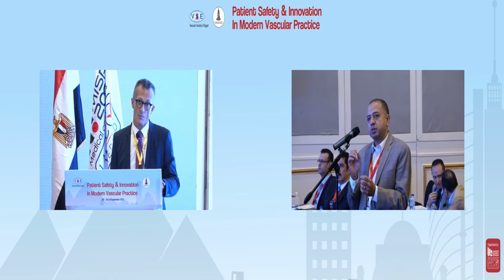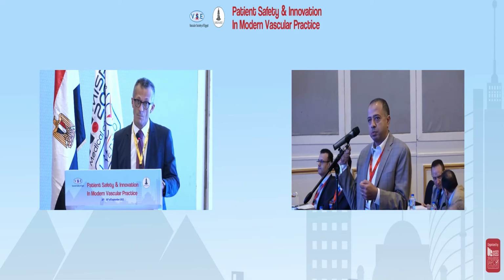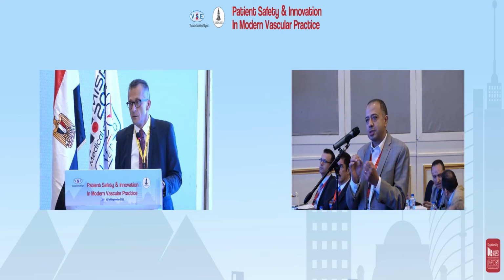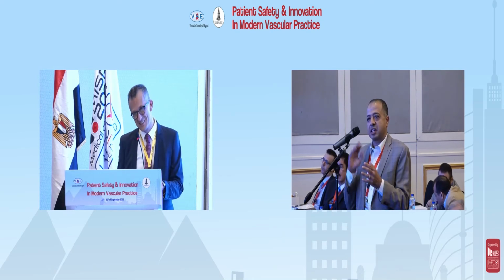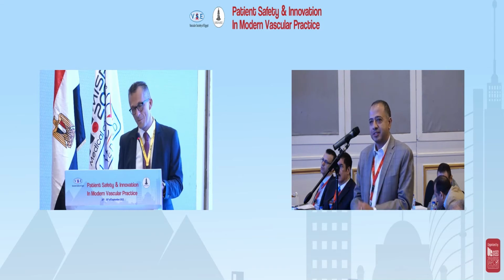You said we proceed until just above the cap, and then we withdraw the catheter. Could you please elaborate again technically what we should do step by step in this last critical point, because this is what we are always afraid of, having a successful use of the device and at the end trashing in the tibials.